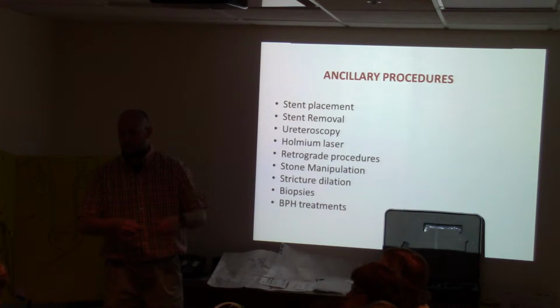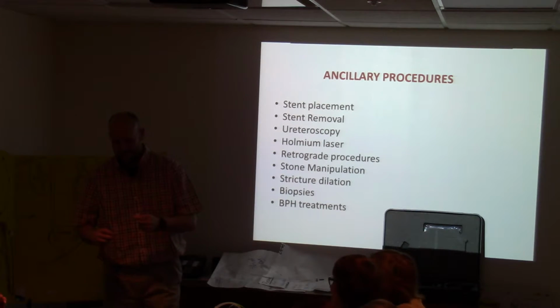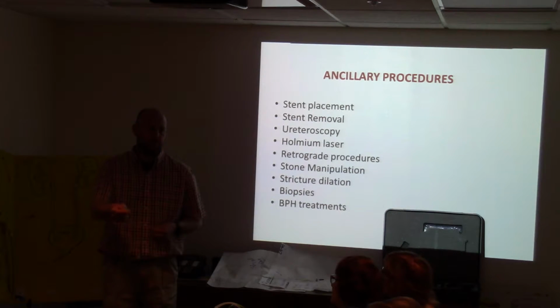How you attach? This is not an injectable. Pretend it is. Use your imagination. So it would attach like this, and then you would inject your contrast through here, and then when you're done, you would just pull that off.